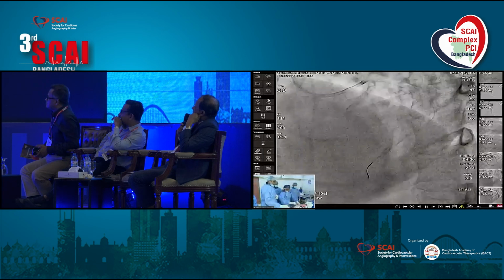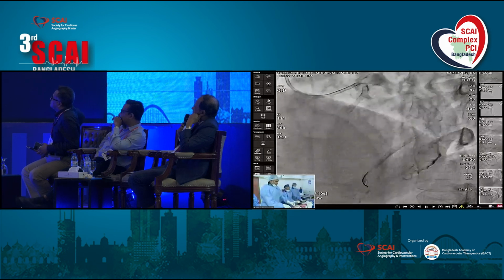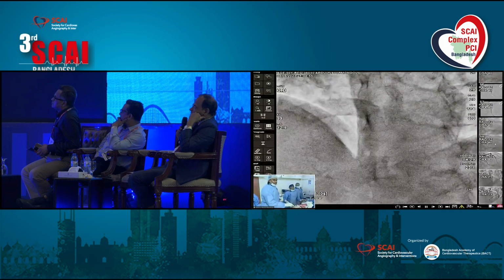Angiographically, that is definitely excellent, and if you do the IVUS, that will give more information. I think Omar, you should also be happy with the result, at least angiographically. So I think we should conclude this session.